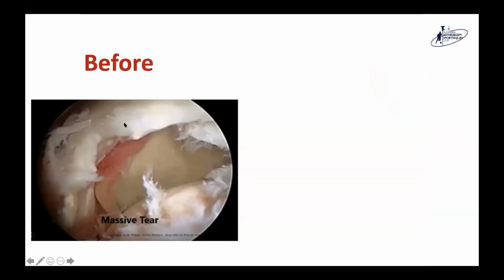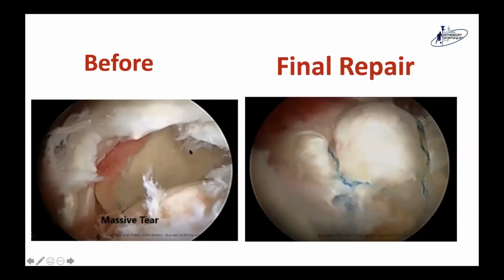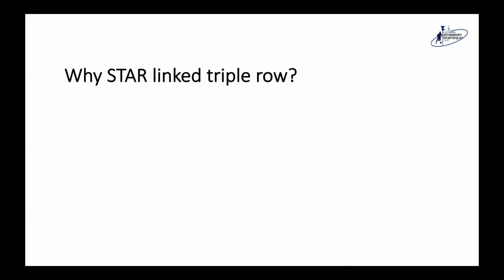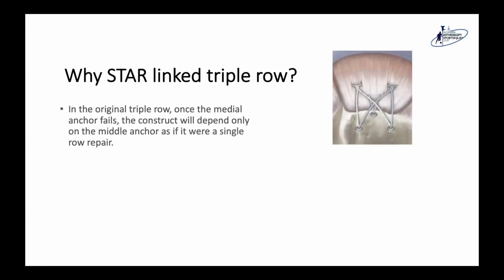So this is one of the cases before the repair, and this is the final after complete closure with a star configuration. This is the post-operative MRI of one of the cases. You can see the triple row repair of the massive cuff tear. So why star link triple row?